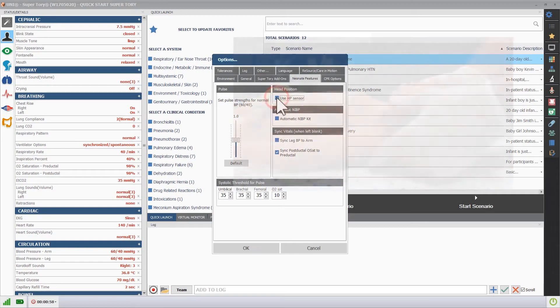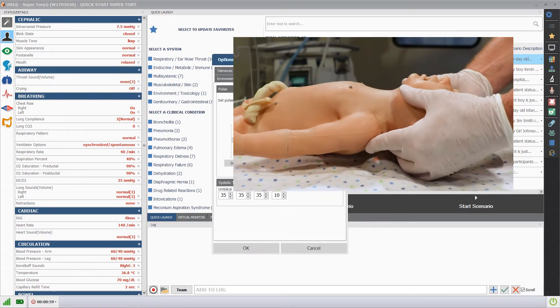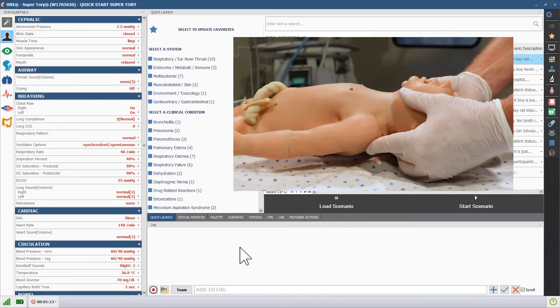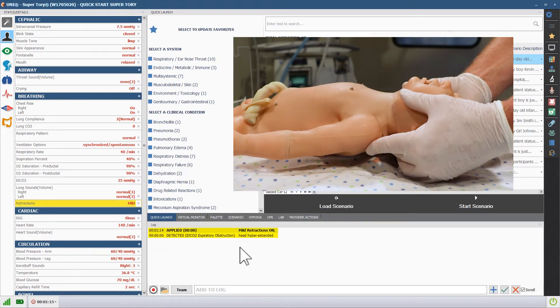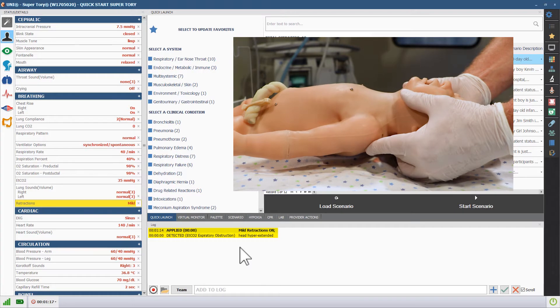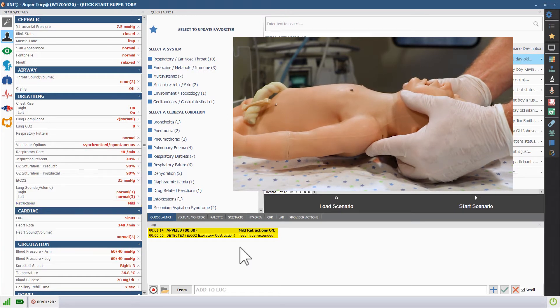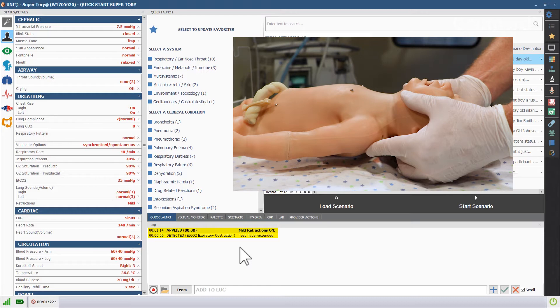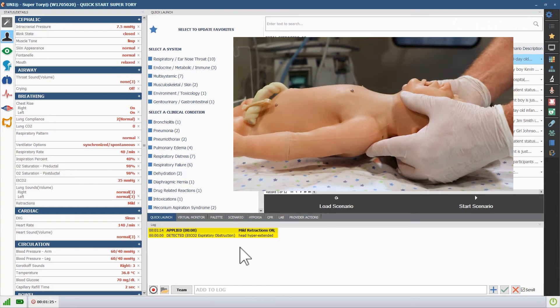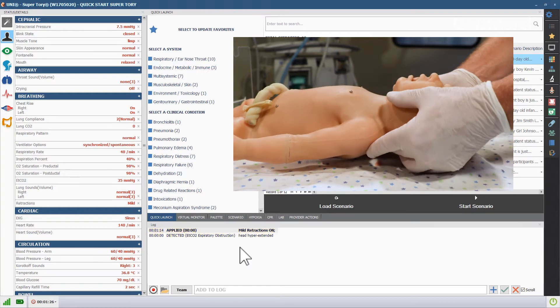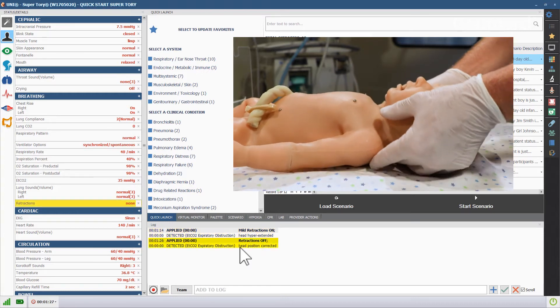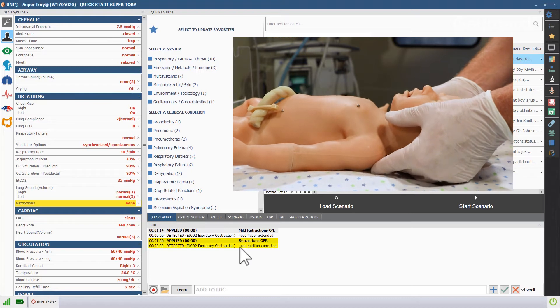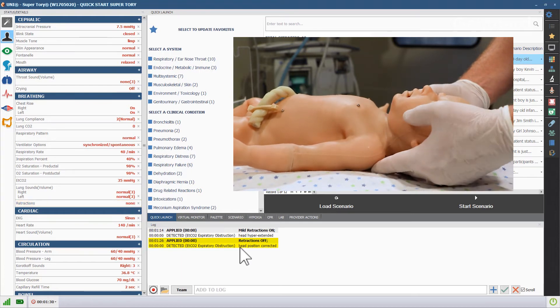When Supratory detects hyperextension or hyperflexion of the neck, the software will log the event and automatically generate mild retractions. When the hyperextension or hyperflexion is corrected, the software will log the correction and turn off the retractions automatically.